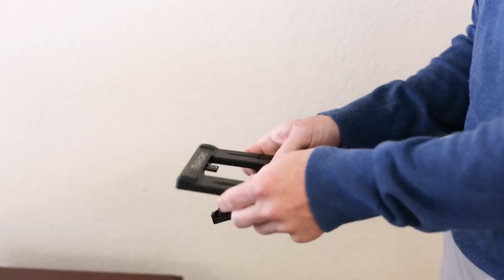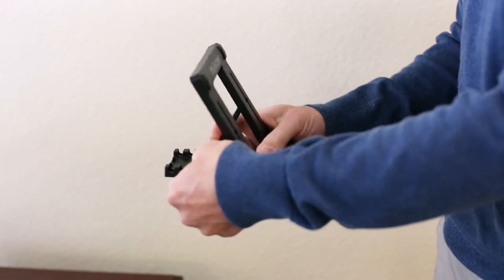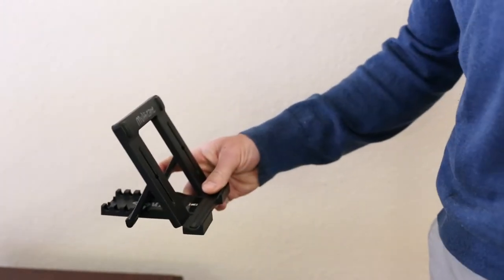You will also receive a tablet stand to prop your monitor up for easy viewing purposes. The tablet stand is adjustable to your preference.